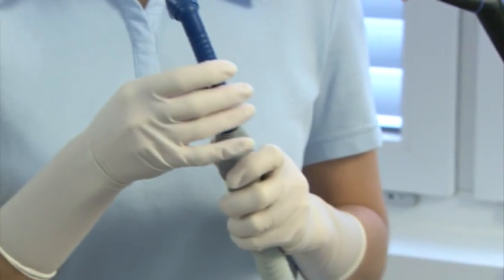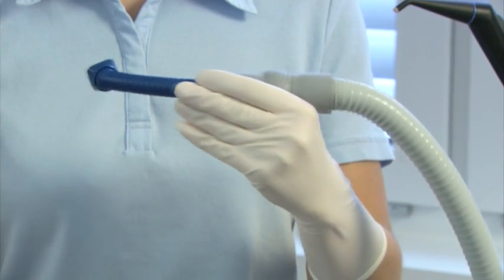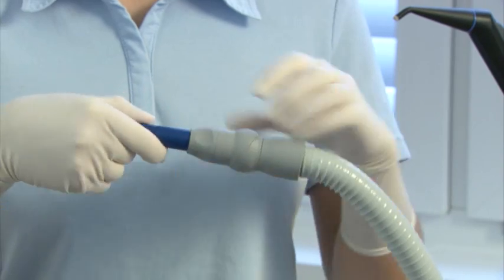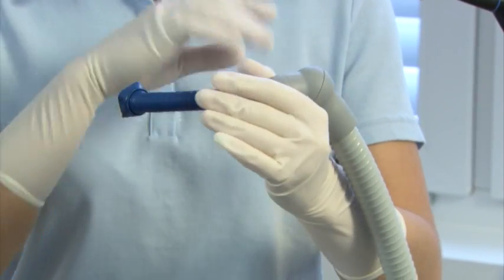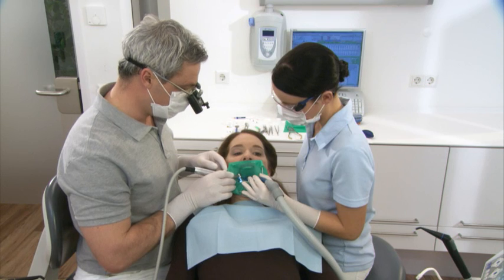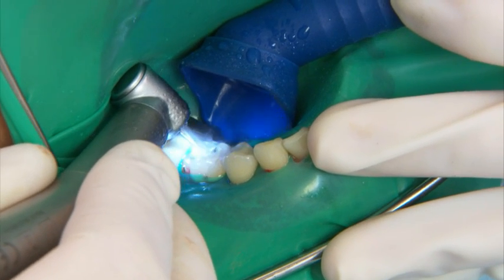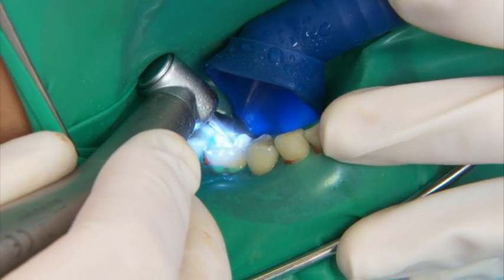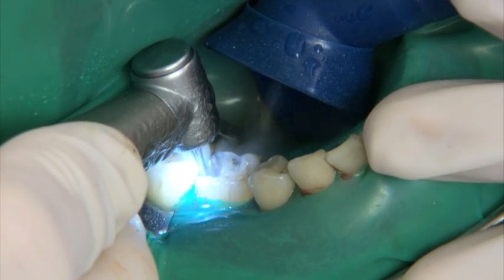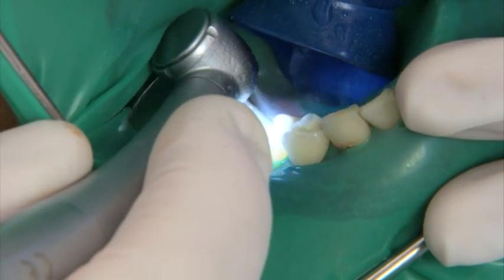The flexible adjustment of the Prophylaxis cannula enables a multifunctional scope of application; the protective shield is turned and set to the right position. The suction handpiece with swivel joint increases ease of use and lifespan of the suction hose. Larger particles must often be aspirated in conservative or prosthetic treatments, such as in the removal of fillings or the transection of crowns and bridges — here, the shield provides additional confidence. The rubber dam technique results in a higher degree of suction comfort.